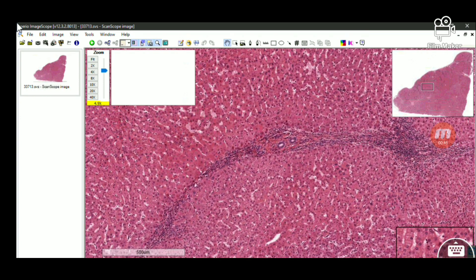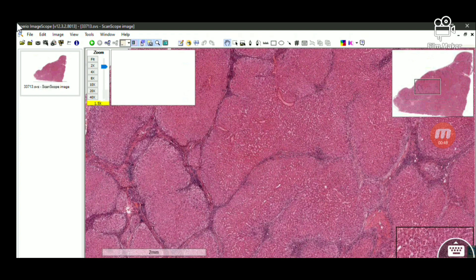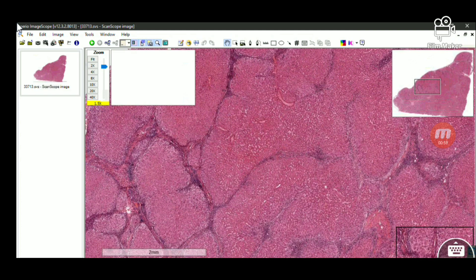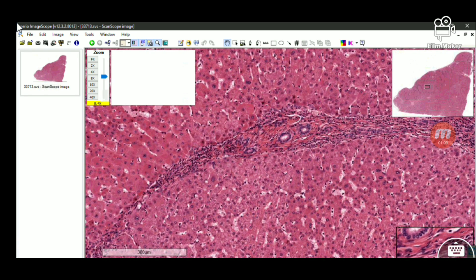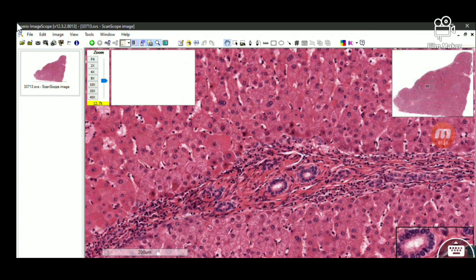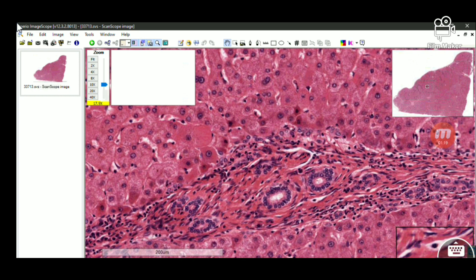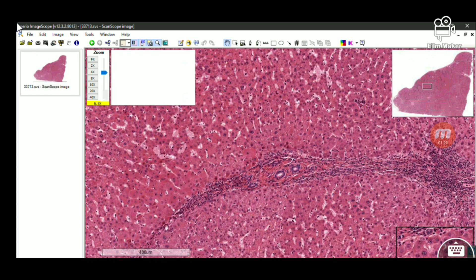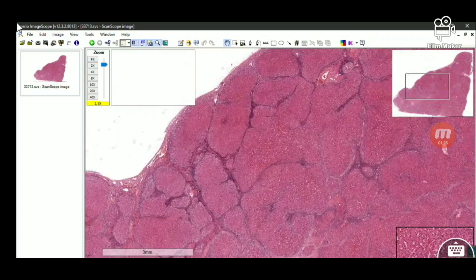If you look at the individual hepatocytes they look quite bland, but sometimes you may see some amount of atypia, which is normal due to regeneration. The nodules are surrounded by fibrous bands, which are also formed due to injury and repair. These fibrous bands run from central vein to central vein, portal tract to central vein, or portal tract to portal tract. In the septa, there is proliferation of biliary ductules. So cirrhosis shows three main features: regenerative nodules, fibrous bands, and biliary ductules.